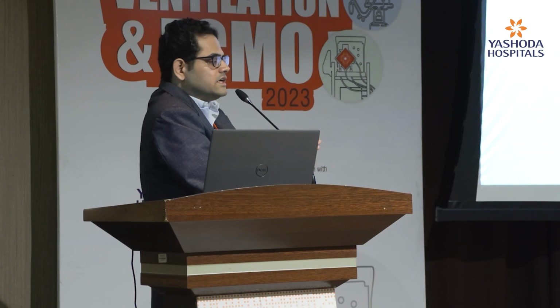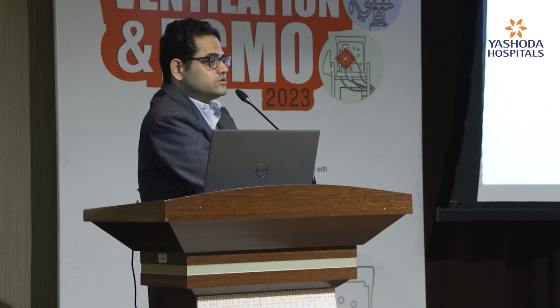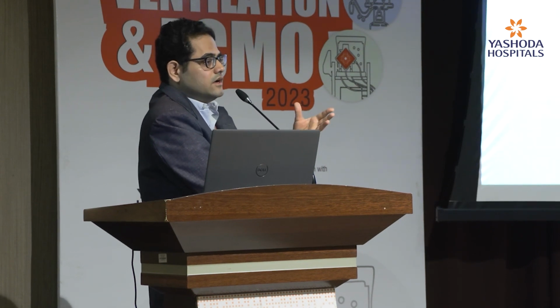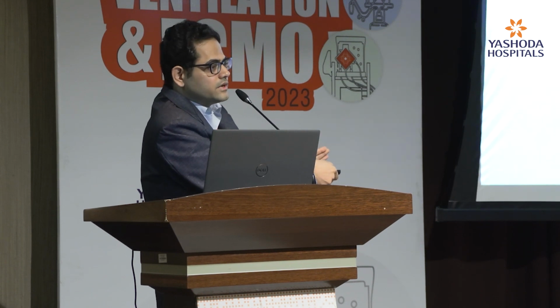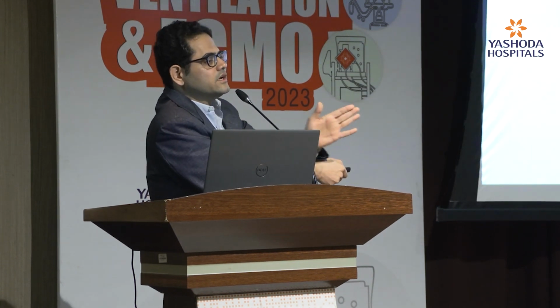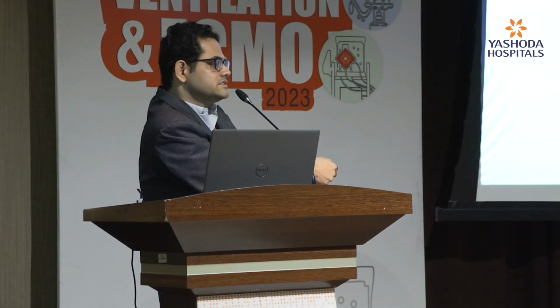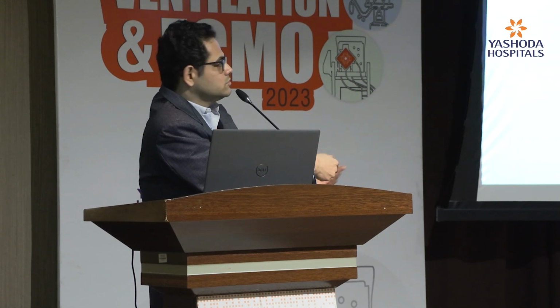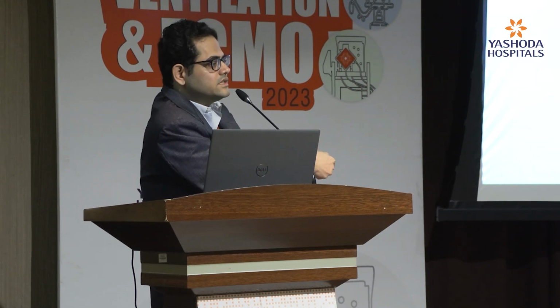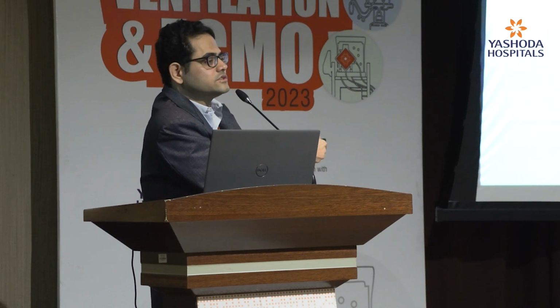But the problem is that the work of breathing will be higher. The certain breaths are not supported, so the patient will feel fatigue. So here, whenever some trigger happens in the mandatory breath, the ventilator will coincide and give a mandatory breath. So usually SIMV is added with pressure support. So certain mandatory breaths, and certain spontaneous breaths which are supported by the pressure support.